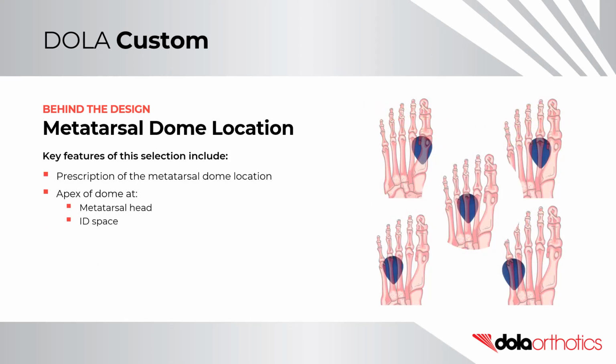Behind the design, metatarsal dome location. Key features of this selection include the prescription of the exact location for the metatarsal dome. The apex of the dome can be placed at metatarsal head 1, 2, 3, 4, or 5, or in an interdigital space 1-2, 2-3, 3-4, or 4-5.